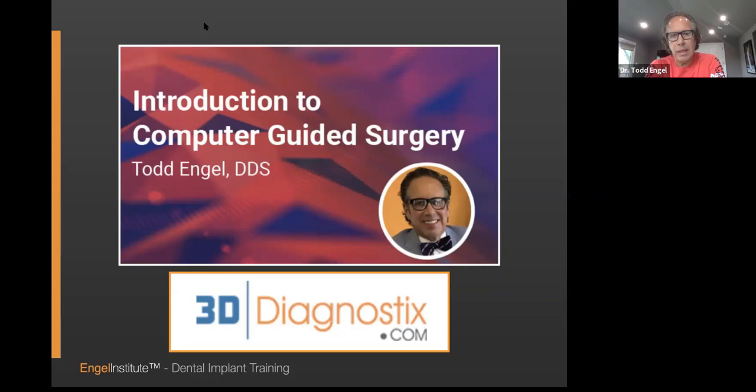This is a basic guided surgery program. So if you're doing guided surgery, the basics are beautiful, as we say. You can't get away from basics. As long as you stick true to the basics, you'll be in great shape. For those of you who have not done guided surgery, this should be a good liftoff for you. I look forward to helping you. I'll show you ways that I will be able to help you beyond this webinar.